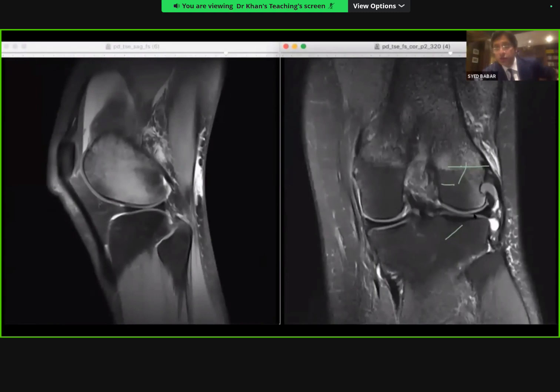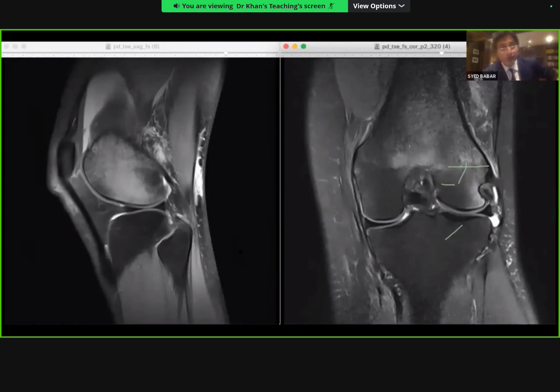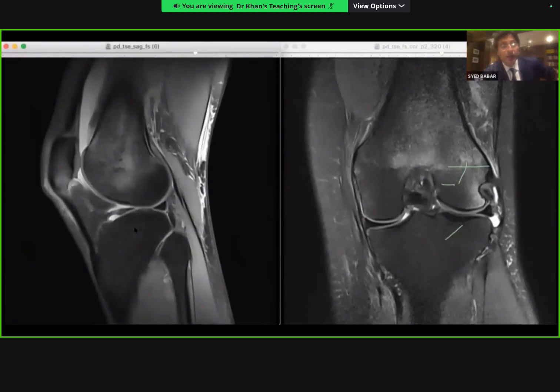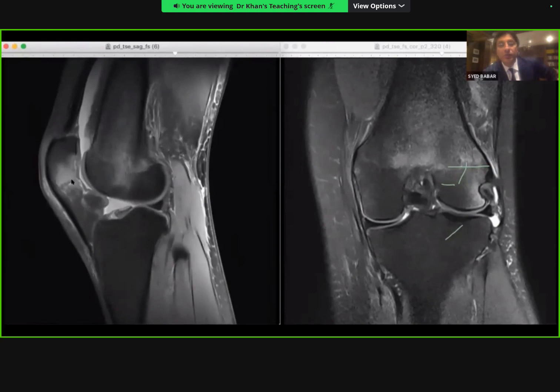Remember the last case I showed you where there was blunting? Look here, the triangle is maintained front to back. So the lateral meniscus is absolutely fine, as you very rightly said. We keep going forwards. And as we are going forwards, can you see that there is additional bone bruising? There's additional bone bruising coming in view where? Patella. You keep going, look at the bone bruising here.